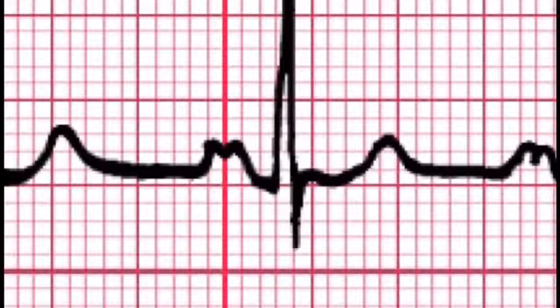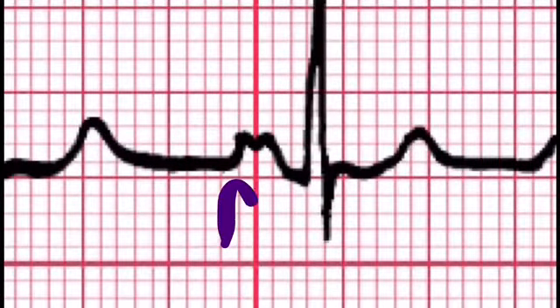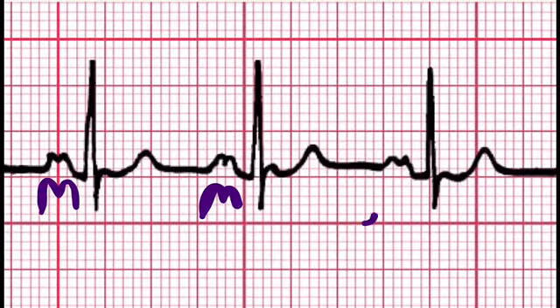Now see this ECG, okay. The earlier part of this P wave is normal because there is a normal right atrium, but the later part is curved, okay. So see, this is making an M pattern. Why M pattern? Because now the left atrium is also influencing the ECG by its own more depolarization vector, okay, because of the enlargement. So this M pattern will be seen when there is left atrial enlargement.